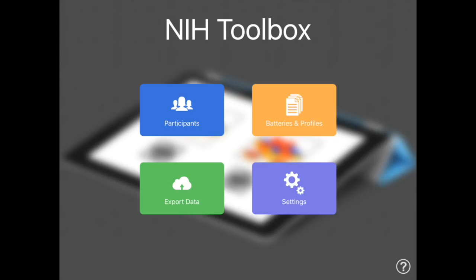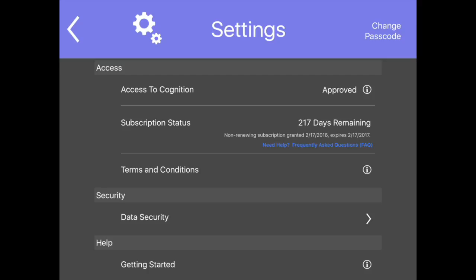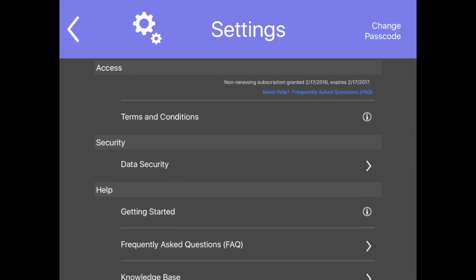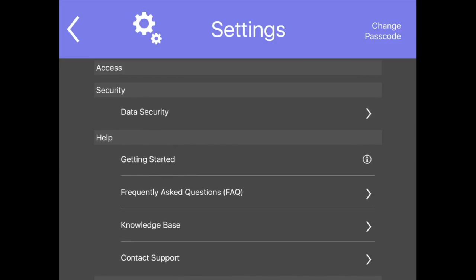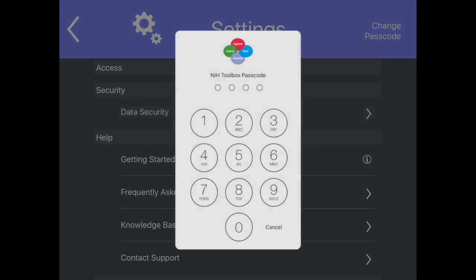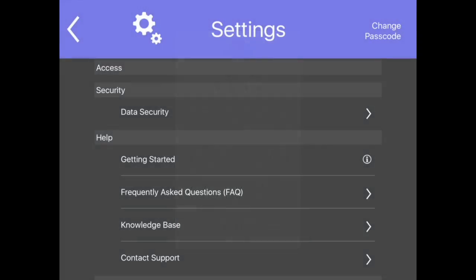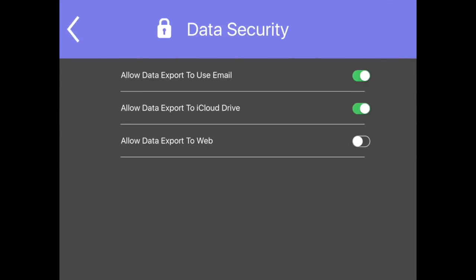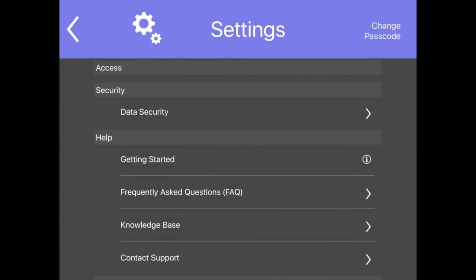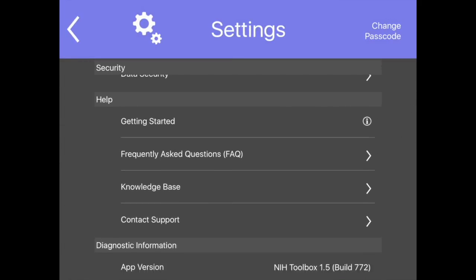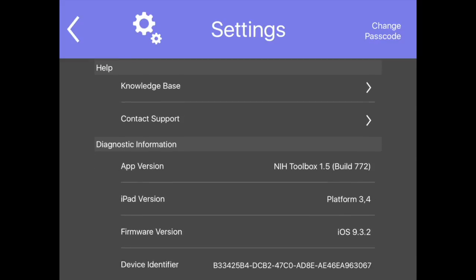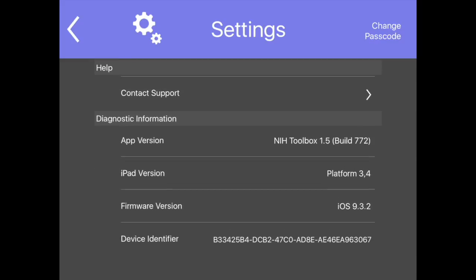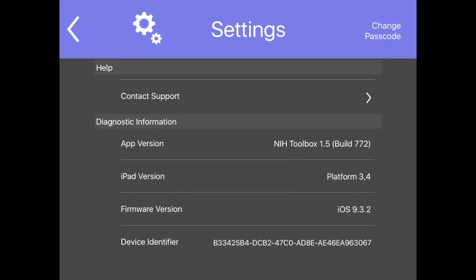In the settings section of the app, you can view and apply for access to cognition tests, view and manage subscription information, view NIH Toolbox app terms and conditions, change the app data security settings, view frequently asked questions, view diagnostic information that may be needed when contacting support, or change the app passcode.